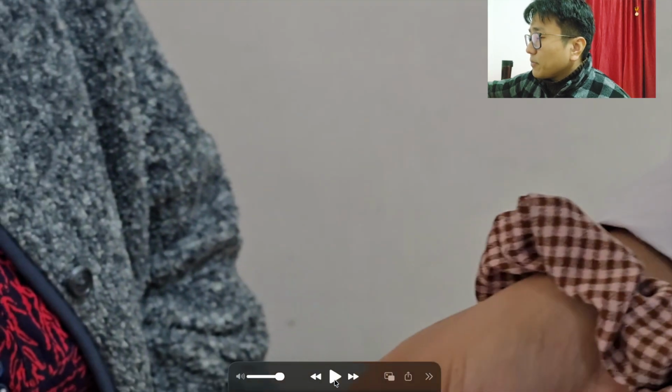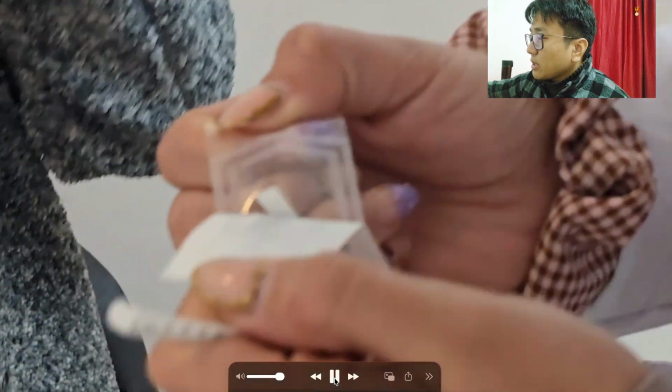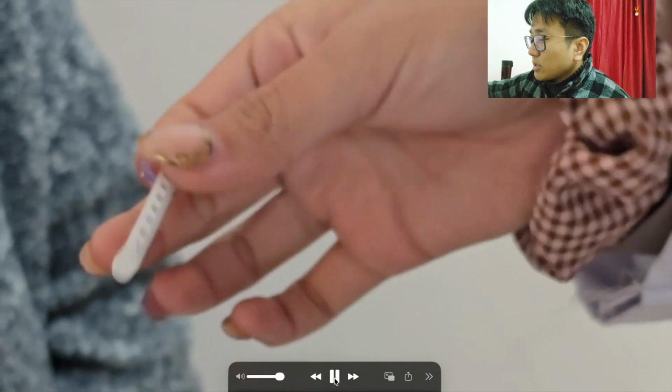And there are many kinds of Schirmer's test. We have Schirmer's test 1, 2, 3. Schirmer's test 1 has without anesthesia and with anesthesia. So what we do is we take the strip out, and for each eye we have to use 2 strips, so 1 for each eye.